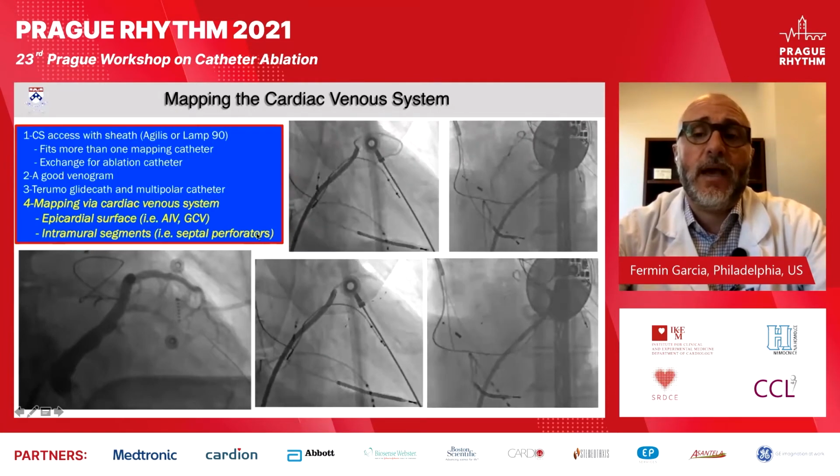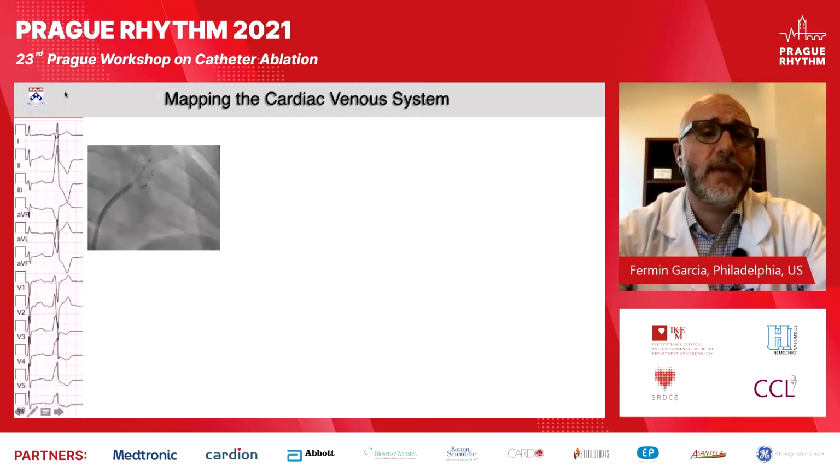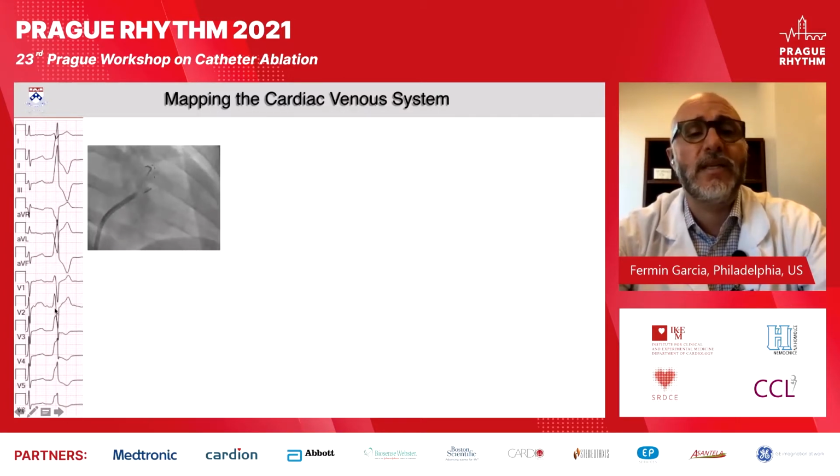And we use this strategy for every patient. So the idea is that if you have a patient with a PVC, classically represented in this example by a left ventricular outflow tract PVC, it's a left bundle with some transition in V3. There's a differential diagnosis for this, but take my word for it, this is somebody that was not coming from the RVOT, it's coming from the LVOT.